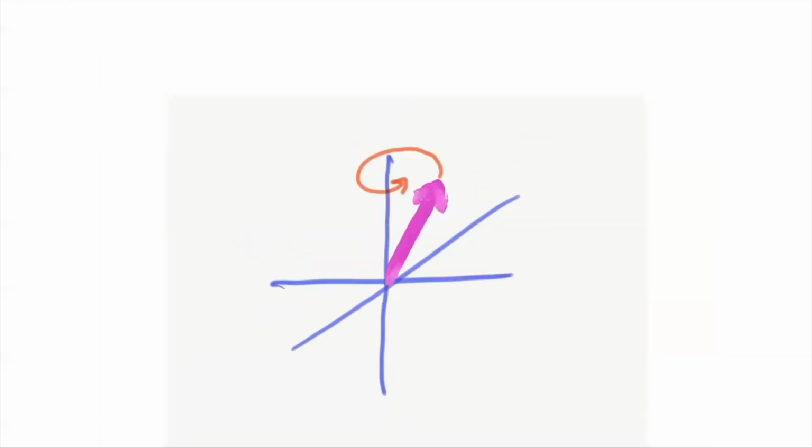Now, as we put energy into the system, this net magnetization vector starts to veer off its baseline position. And so the advantage of this drawing of the rotating frame is that the frame is rotating at the same rotational velocity as this proton vector.